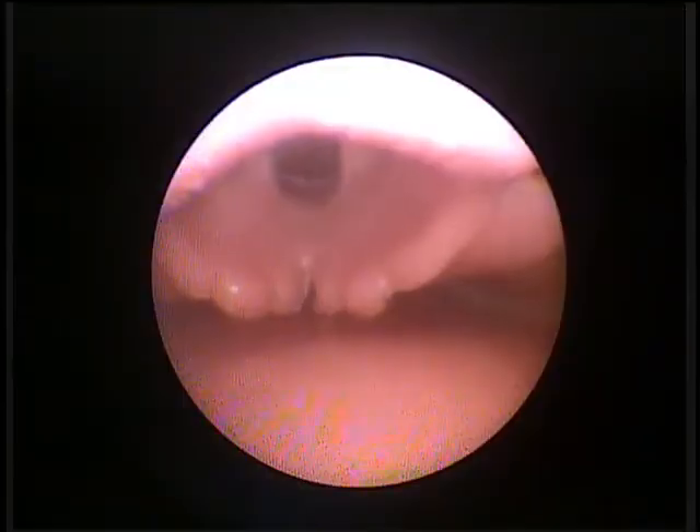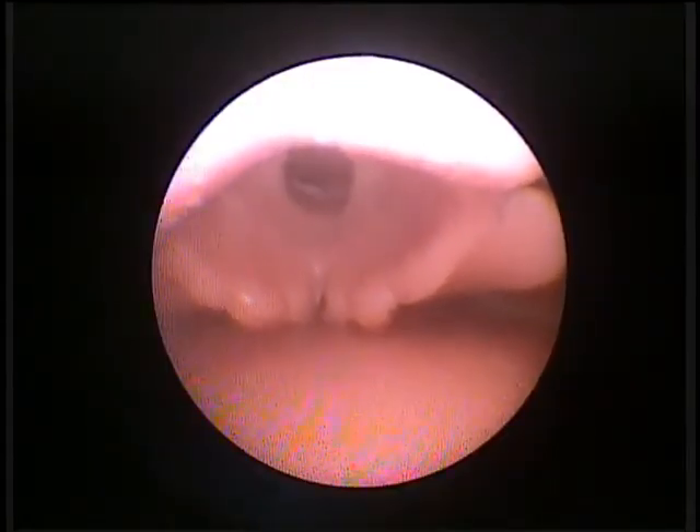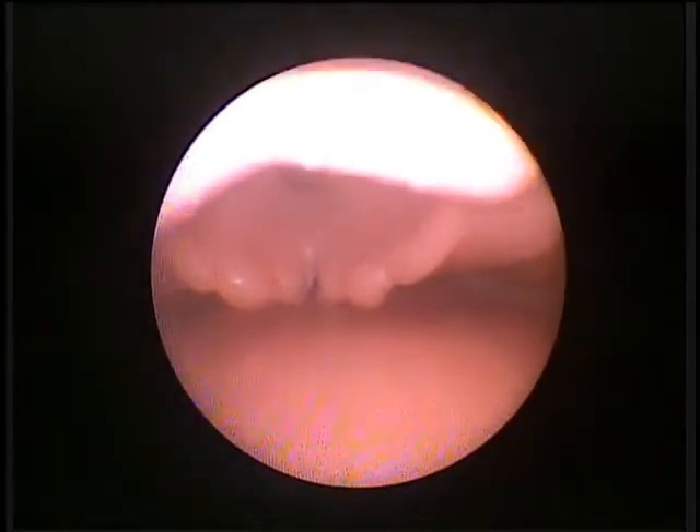The next step is to find the posterior notch. Already, seated in the vallecula without any force, I can see my posterior notch. The interarytenoid notch and posterior cartilages are in sight — that's my landmark. Until I find that, I don't know where the cords are. Once I do, I know I can intubate this patient. So first you find the epiglottis, then you find the notch. Once you've found the notch, you optimize your view — this is the first time you lift the laryngoscope while doing more external laryngeal manipulation. Now I have a great view of the cords; I can see my notch, my cartilage, and my cords.